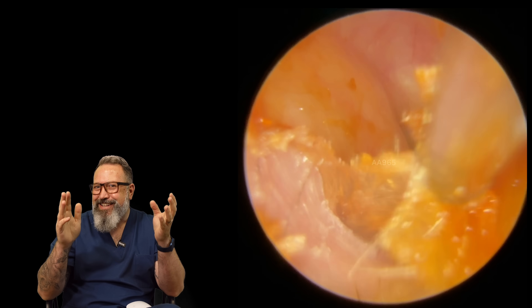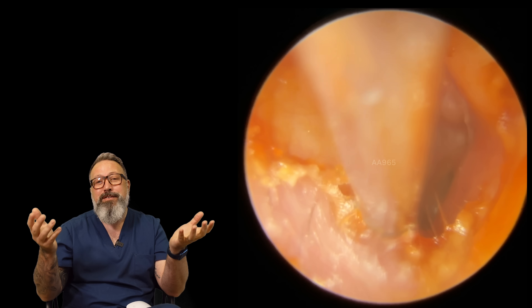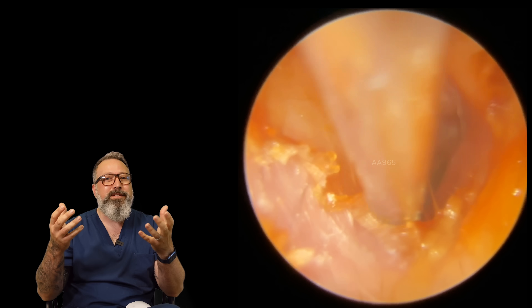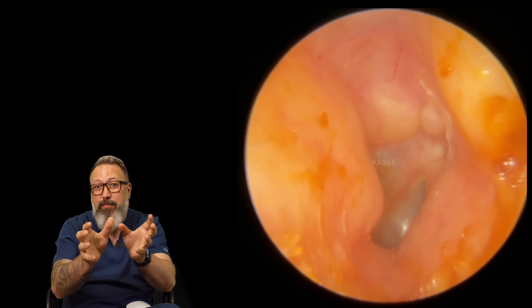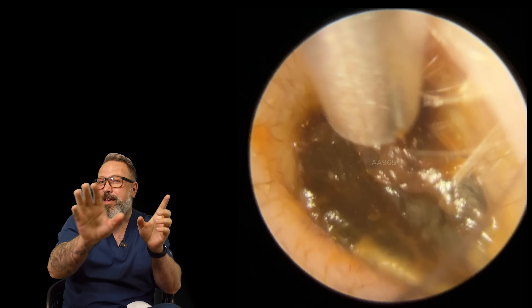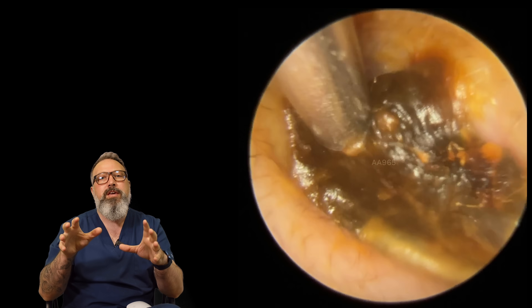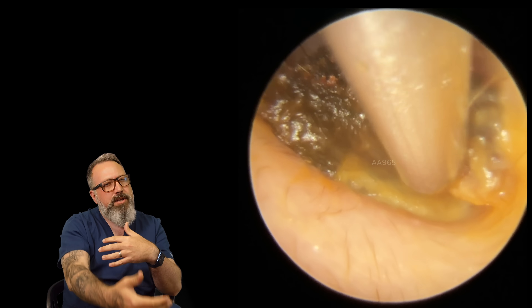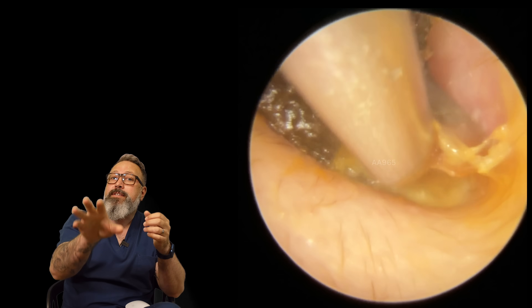I've always said exostoses come in threes, so why do we have four here? With prolonged, repeated water exposure you're not limited to three - you can get a bonus exostosis. Actually there are five if you count carefully: one, two, then another on the right, and two at the top near the eardrum. It's really important to keep on top of wax production in these ear canals - if wax forms on the other side of those lumps and bumps, it becomes very difficult to remove.